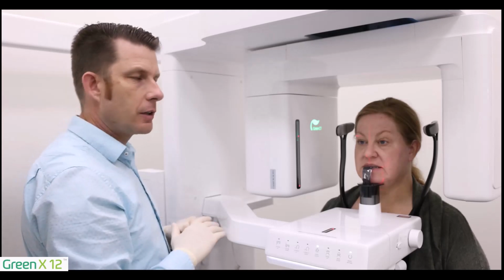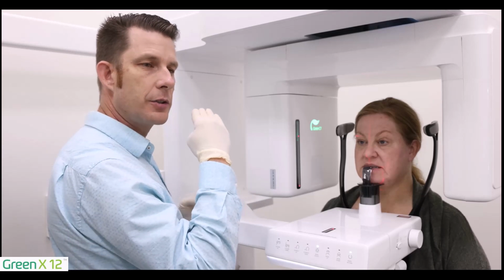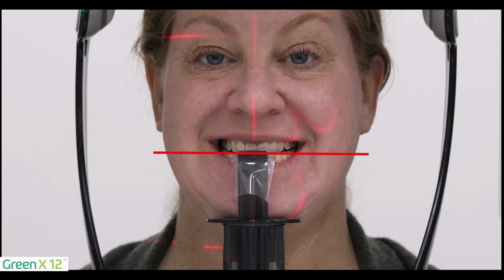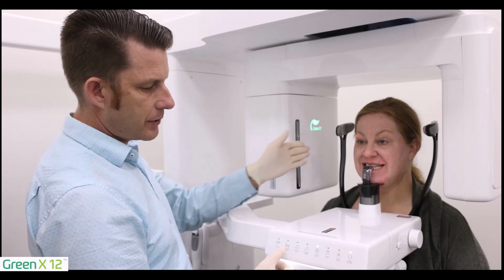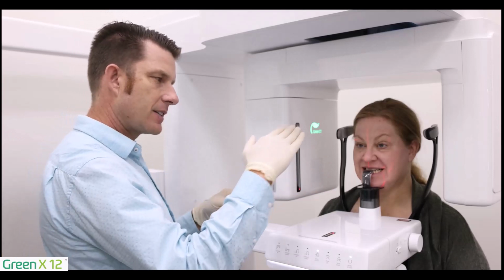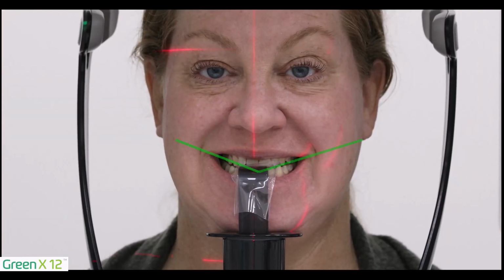Next thing I want to do is look at the patient's occlusion. I want a natural head position or the patient's occlusion tipped down 10 degrees. Go ahead and smile for me really big. And to me it looks like the patient's occlusion is very flat, and I want to lower the patient's head down. I'm going to do that by the column up or down. So I'm going to lower the column, which is going to tip the patient's head down. Go ahead and smile again, and I can see my occlusion is tipped down about 10 degrees.